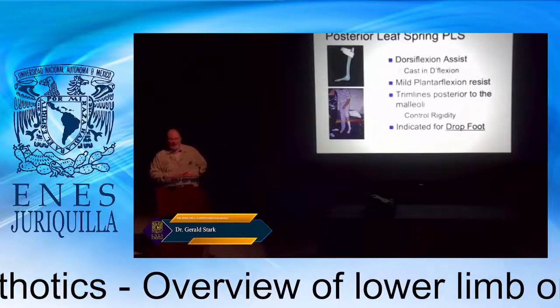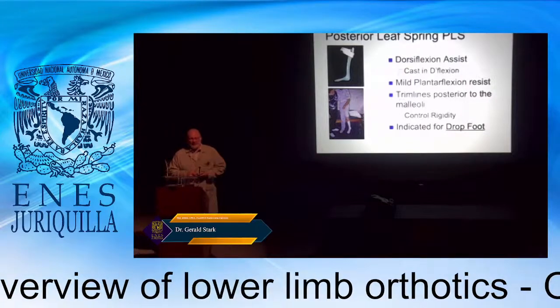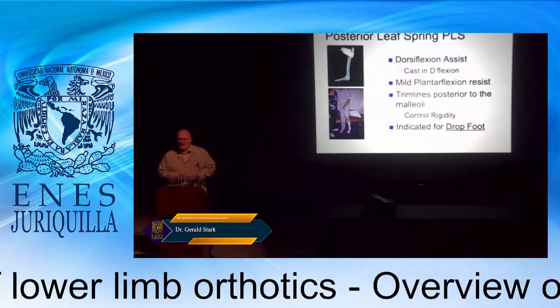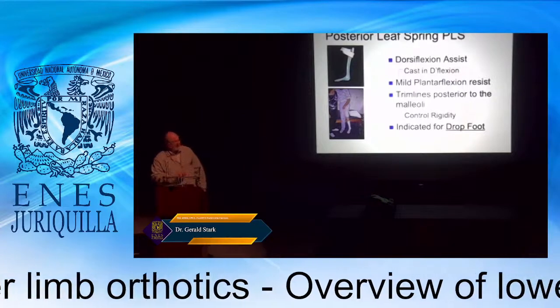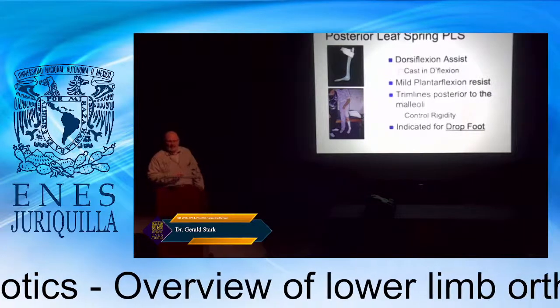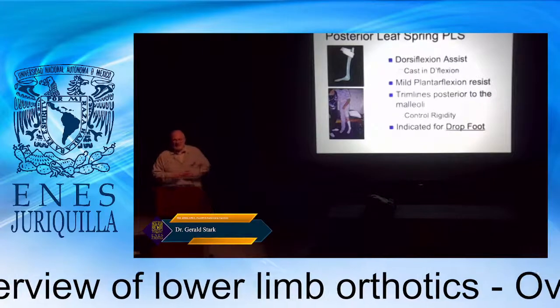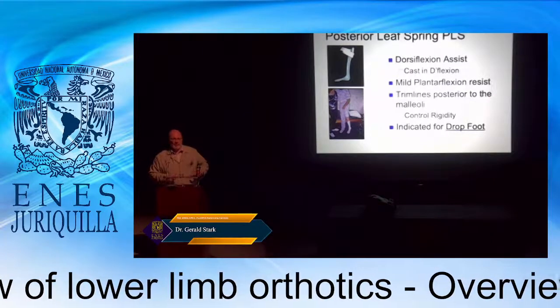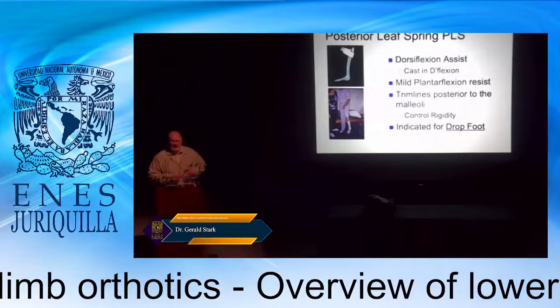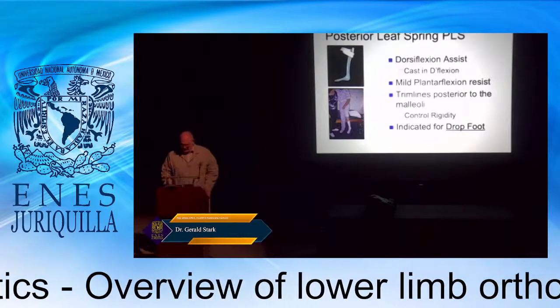We have the walk-on device from Ottobock. There are other types of carbon devices that you can utilize that control this rate of dorsiflexion, either slowing it in early stance with an anterior panel or allowing it and addressing the late stage stance. Actually, the anterior panel addresses late stage stance, and the posterior panel addresses early stance phase or heel strike.